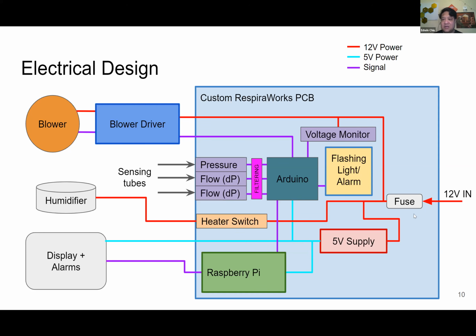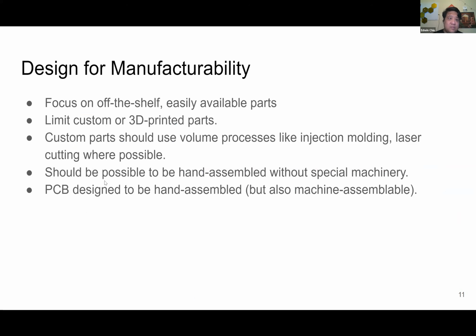And we've also been discussing the possibility of adding an additional small battery on this board to allow the system to sound an alarm if the 12-volt itself is disconnected. But it won't be able to keep the blower or everything else running.